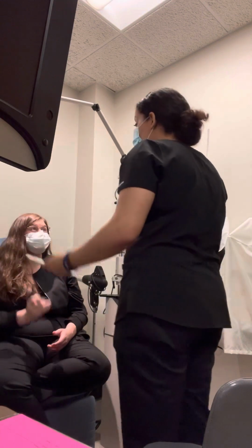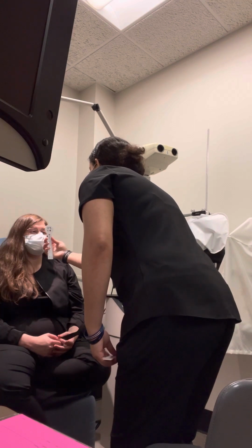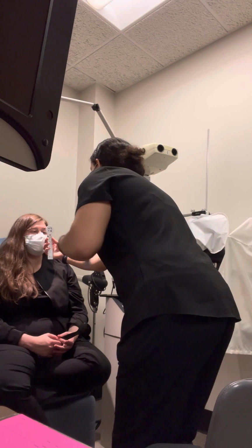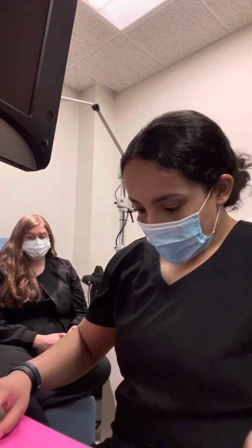Okay, now we're just going to be doing the same thing with both your eyes. Let me know when it gets blurry. Flashing some light in your eyes here. Blink a few times for me. Does it clear up? No. Okay, go ahead and close your eyes for me. Okay, alright. I'll go ahead and take that from you.